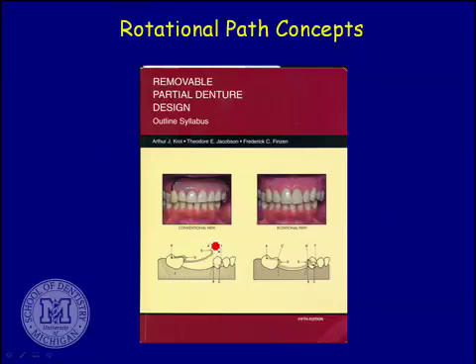If you're trying to survey that case to give you a nice straight path of insertion, it's reasonably difficult, because where the tooth is leaning lingually, if you're trying to find a path of insertion that lets your partial denture come down past the lingual cusp of the tooth, when it gets down to the inferior edge of the framework, it's nowhere near the tissue. You might have a hard time uprighting the lingual of that tooth enough, and similarly for a mesial tilt.